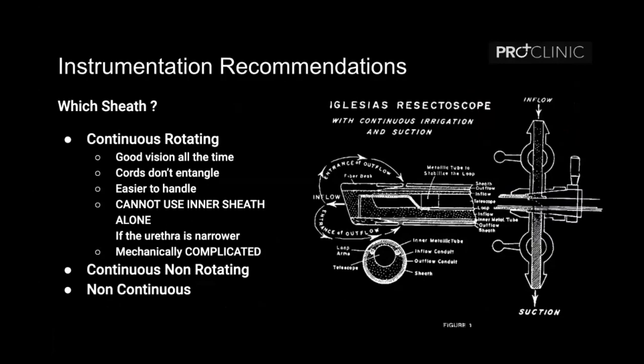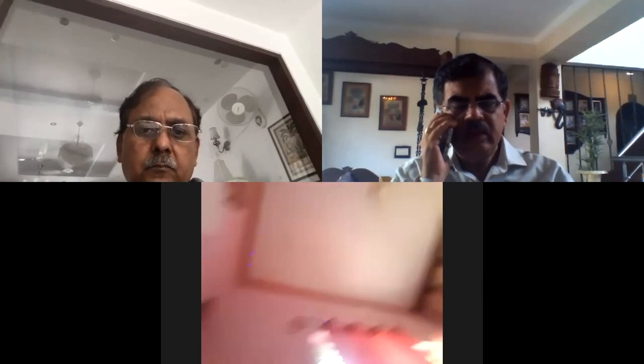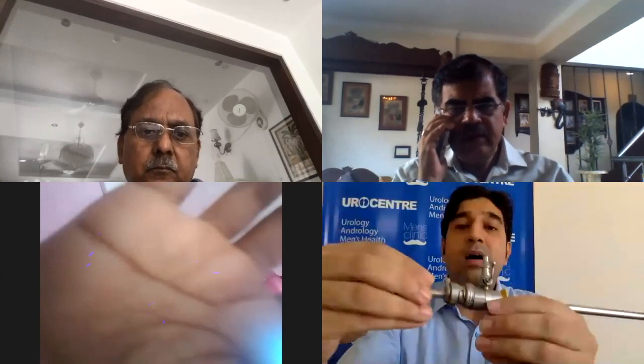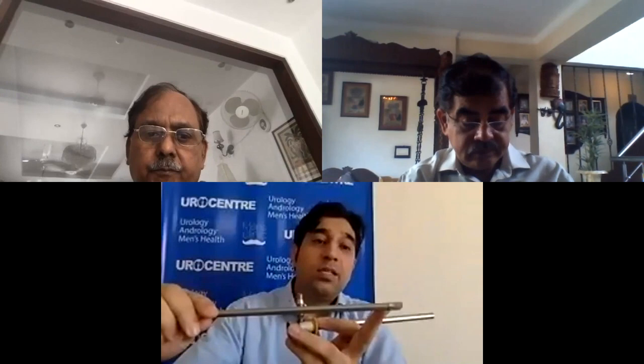Coming to instrument recommendations — which sheath should a resident use? We are now using the continuous rotating type of sheath. I will stop sharing the screen and give a physical demonstration. So here is the assembled resectoscope sheath — this is the continuous rotating type. Here we can see the complicated tip of the inner sheath and the outer sheath. Just by looking at the outer sheath we can say this is a continuous rotating type of resectoscope.